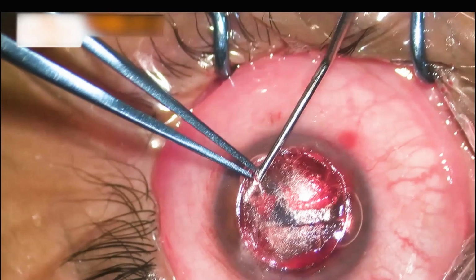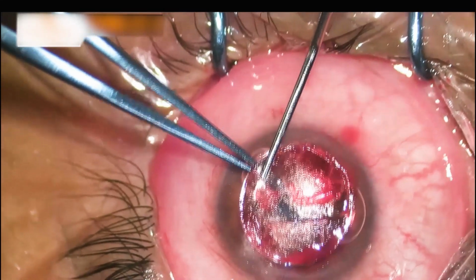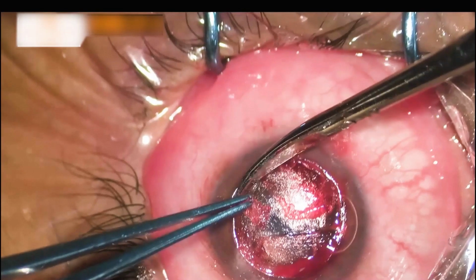The procedure is repeated again and again to dissect out the stromal lamella and perform manual dissection of stroma.